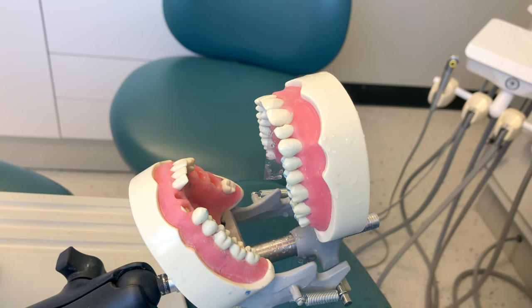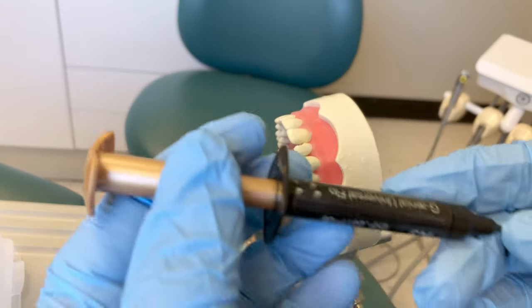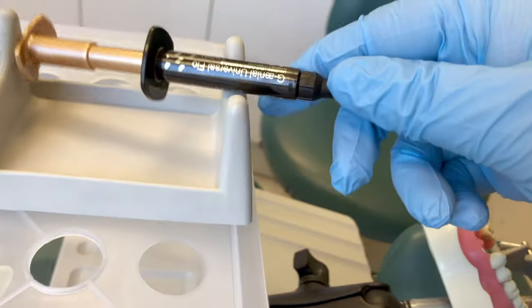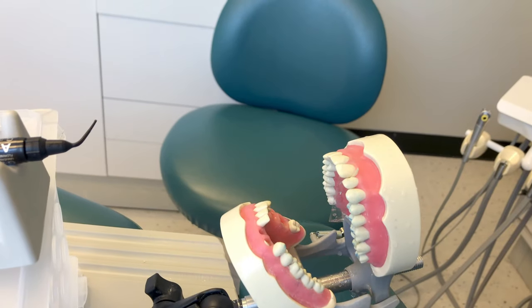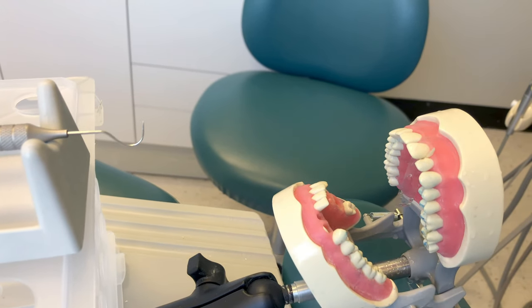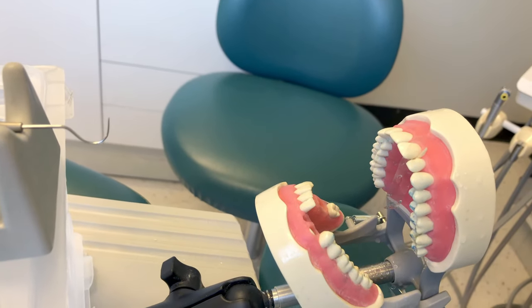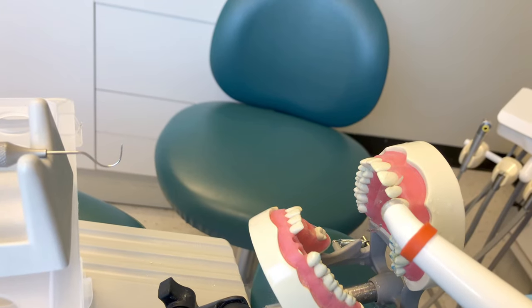The bonding agent acts as an adhesive for the layers of composite to bond to the tooth. Next up is flowable composite, which usually comes in a syringe and is passed to the doctor similarly to the etchant. We hold the tip and deliver it into their hand. While the doctor uses the flowable composite, get the explorer ready and a piece of gauze. Be careful when wiping sharp instruments — come at the instrument from the side and wipe away from the tip.